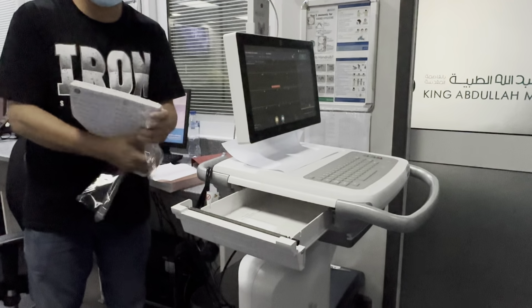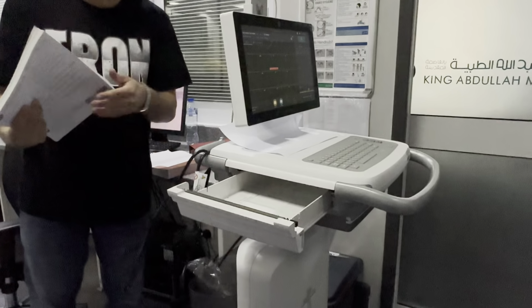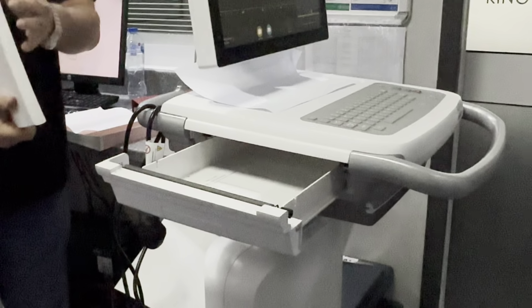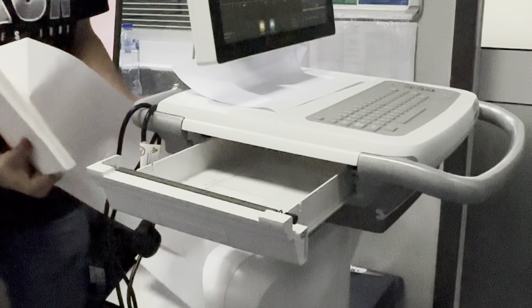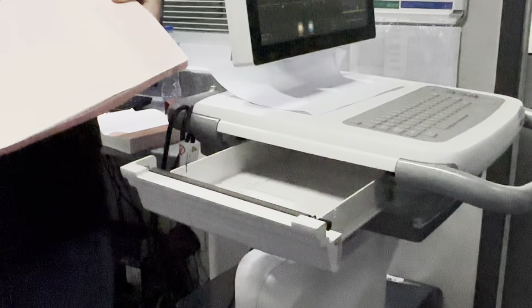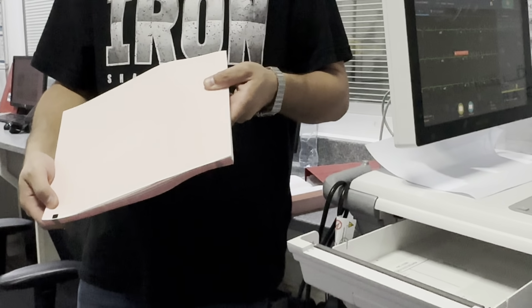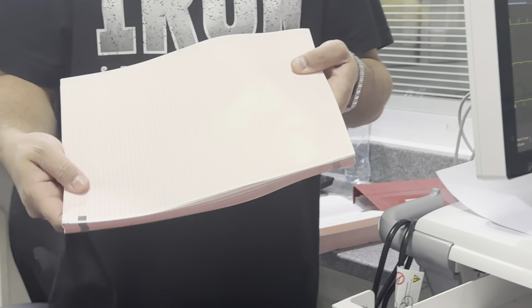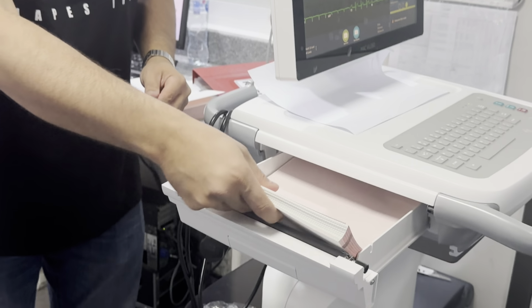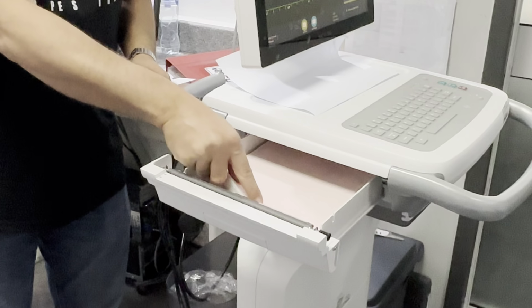So we have this type of paper. We recommend using this type of paper, which was delivered with the machine and later on will be a stock item in your hospital. It has a black square on it. This is your new indicator with this type of paper. Your black square will be in the lower left part of the machine. So you place it that way. It's going to fit the tray size.